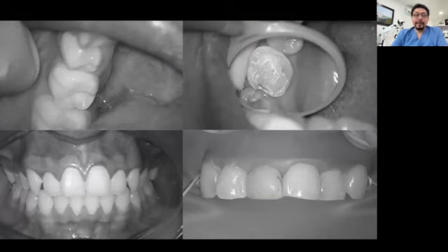If we analyze these pictures, maybe some of you already have an idea related to some diseases that are present in these patients. You can see that there is maybe some gum inflammation, maybe some plaque retention in some areas, maybe caries, maybe some poorly adapted obturations. And we already have an idea because we have the clinical experience for trying to understand what is happening there. But if I give you colors, it's more obvious what is happening in each picture.